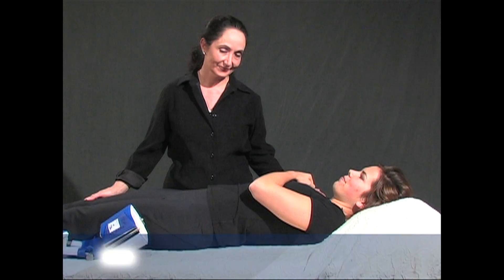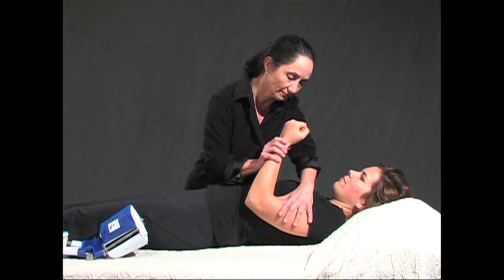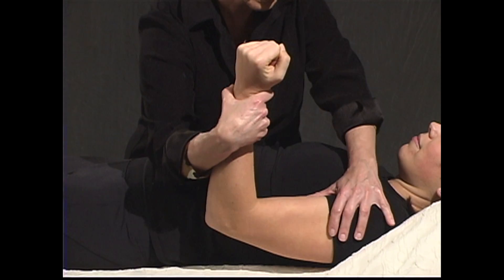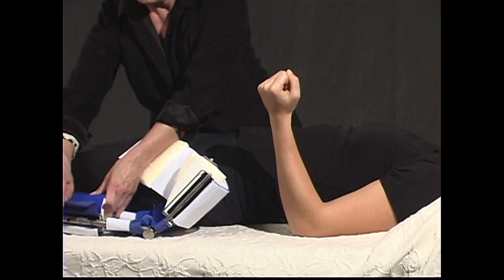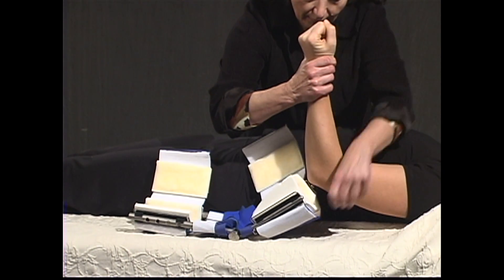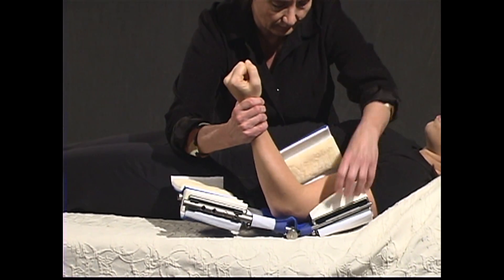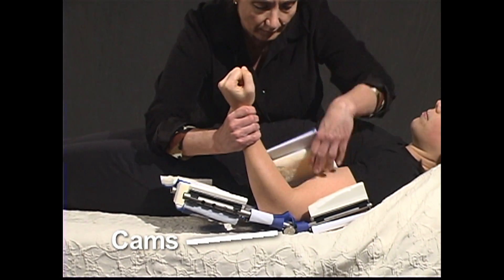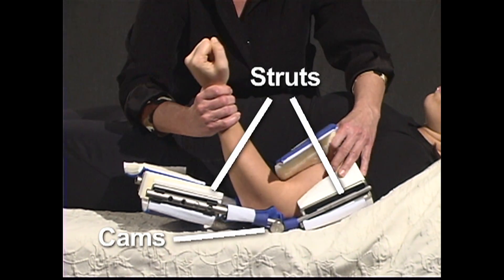When applying the neurological elbow extension DynaSplint, place the patient in a supine position. Stretch the arm out gently and open both front cuffs. Position the patient's arm with thumb in the neutral, or thumbs up, position. The elbow cams should line up with the elbow, with the struts going midline along the arm.